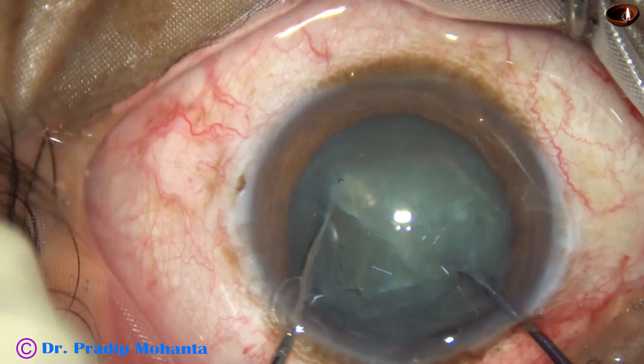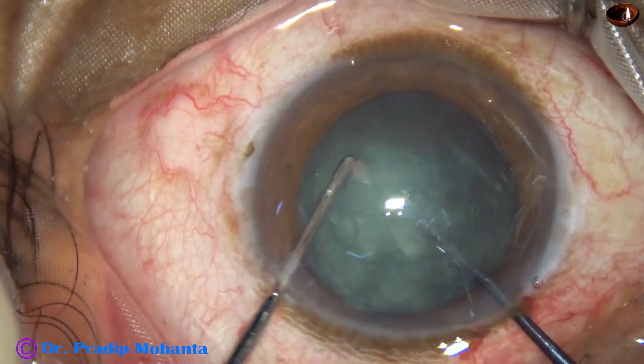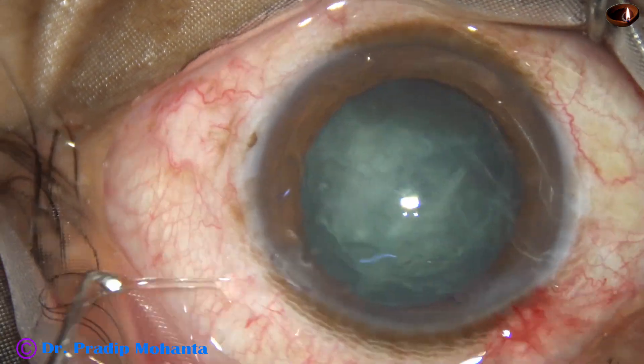This is the first pre-chop, dividing the nucleus into two hemi-nuclei. Then one hemi-nucleus is divided into two pieces, and I come out.